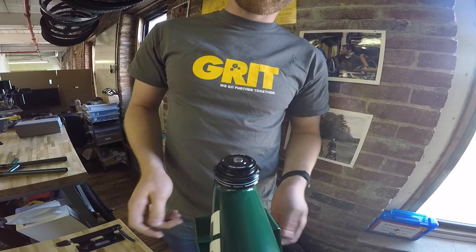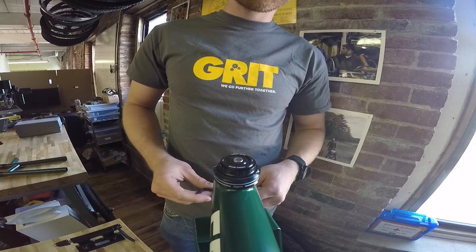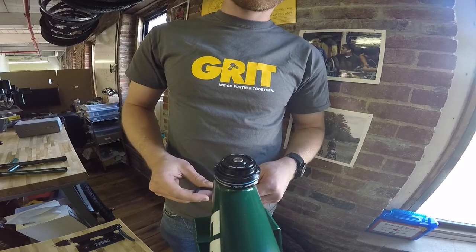So there you go. That's how you assemble the Freedom Chair front fork.